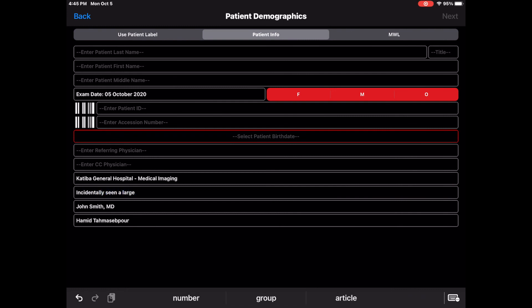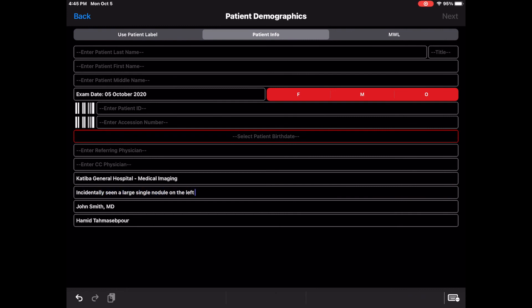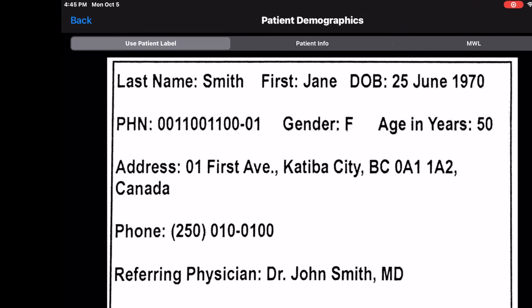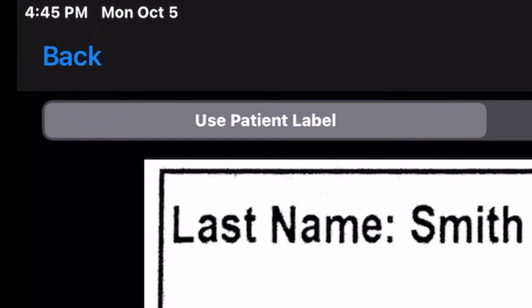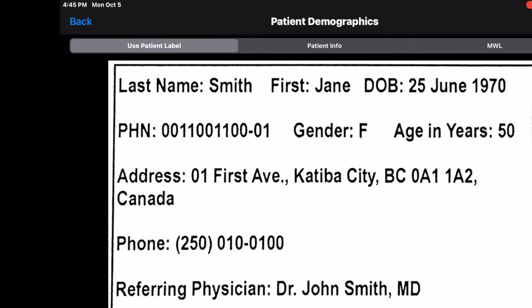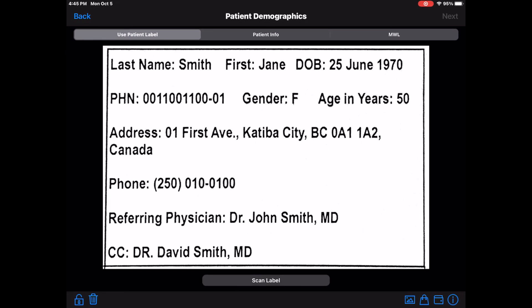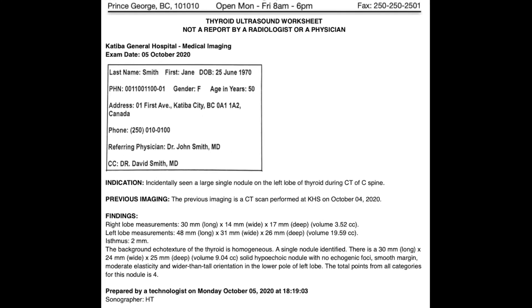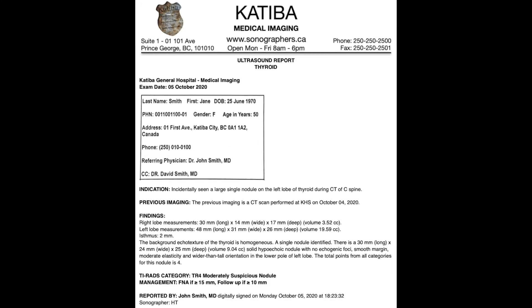Once you are finished with the indication, make sure you have selected Use Patient Label before going to the next page. This label will be replacing the Patient Demographic section on the worksheet or report.